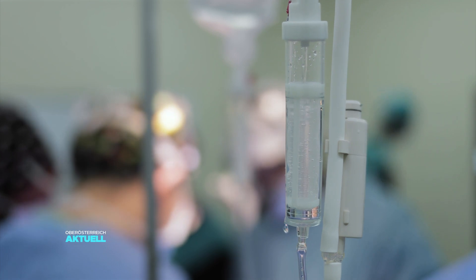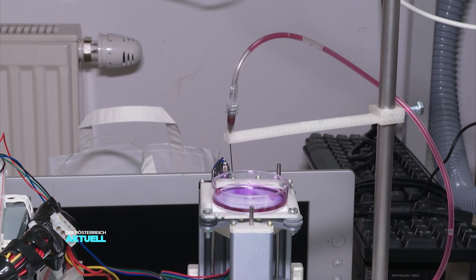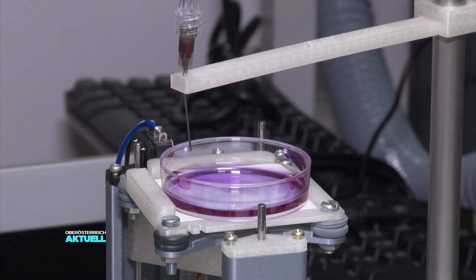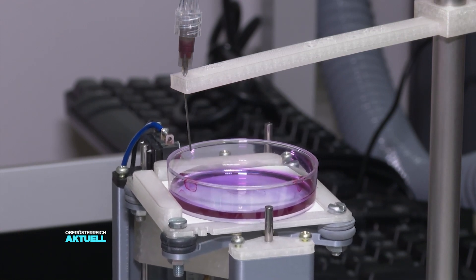Therefore, research scientists worldwide are currently trying to produce artificial organs from 3D printers. What is needed for this process is a very large number of cells, which one would have to cultivate. All of the cells would then be mixed with a hydrogel and used to create a bio-ink. Organs could be printed with bio-ink from human cells.